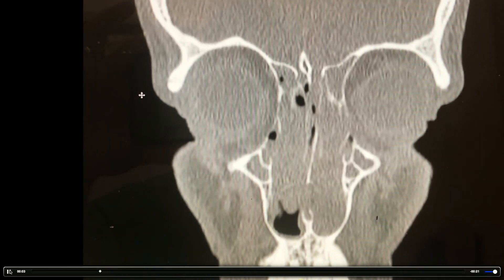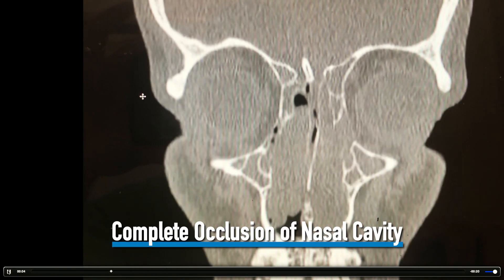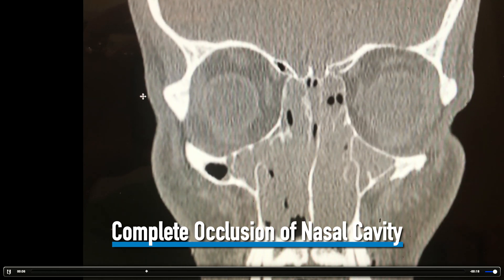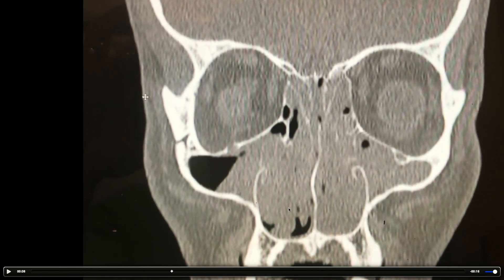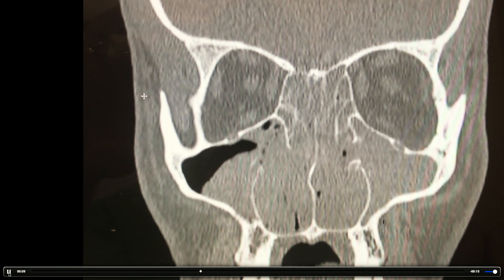Here we go again — here's our coronal cuts. Notice right here: all this is polyps hanging down in that left nasal cavity. There's a touch of air going up towards the skull base, but that's it. This patient is not breathing well. As we keep going further back, what you'll see is complete occlusion of the nasal cavity. There is some air in that right maxillary sinus, but pretty much everything else is occluded.